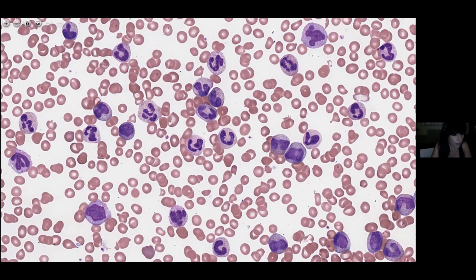A film like this, especially if you're starting off looking at morphology, is really good to appreciate the different stages of neutrophil maturation. You pretty much get all of the cells apart from the promyelocytes. So it's really good just to review the different stages. And if you want to look at promyelocyte morphology, then look at cases of APML.